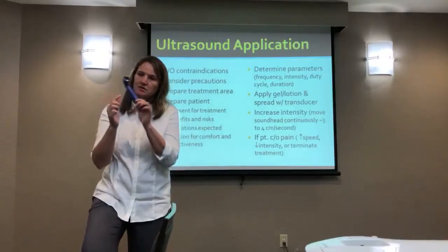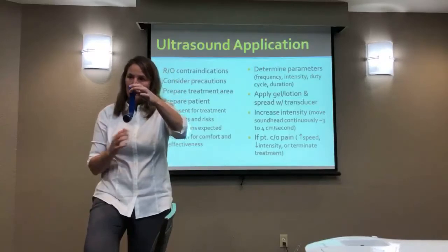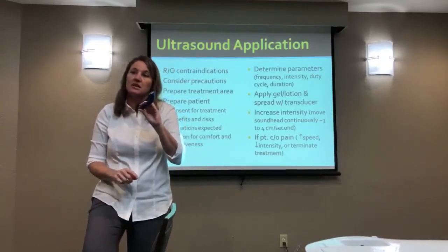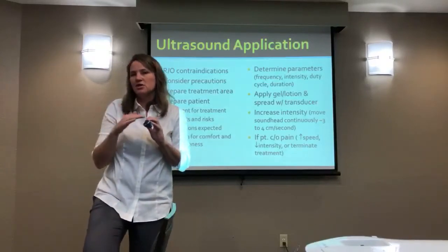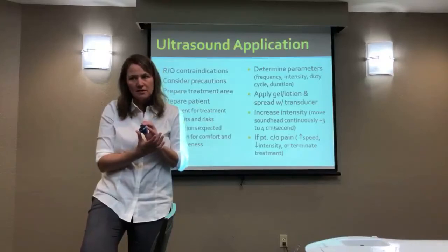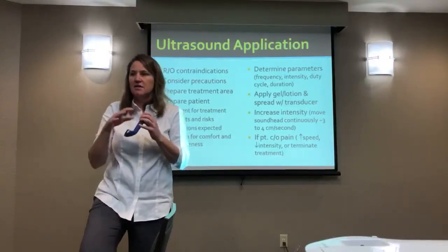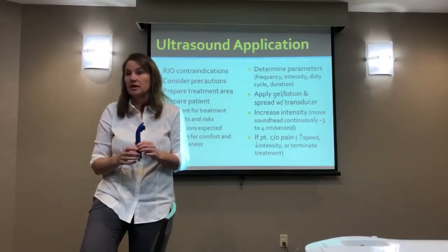And for this particular head, I would more dunk it in something, or make sure it's very, very wet and gets up in the cracks and crevices to make sure it's clean, especially as an ongoing practice. Because even if you didn't do a really good job once, you may be okay. But if you're day after day not quite cleaning a piece of your equipment well, it could catch up with you, and then you could have a problem.